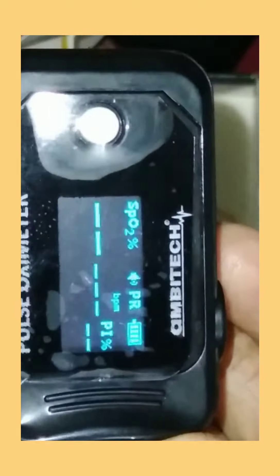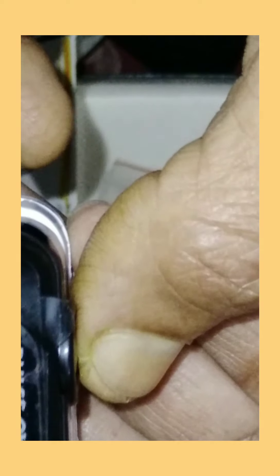If you want to turn on the monitor, you can see the display on the monitor. I will insert the battery and press the button. If you want to show the display on the monitor, you can see the display on the monitor.